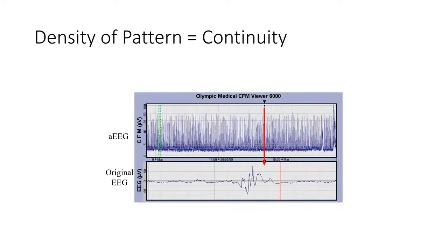I'm going to use burst suppression to help illustrate this, because I think it does it best. Let's look at the EEG first. On the EEG you have this suppressed activity and then a burst. Again, you have this mixing of voltages, which gives you a rather low bottom margin and a rather high upper margin. And what we see with this, when there are more than 15-second gaps between bursts, is blank space.